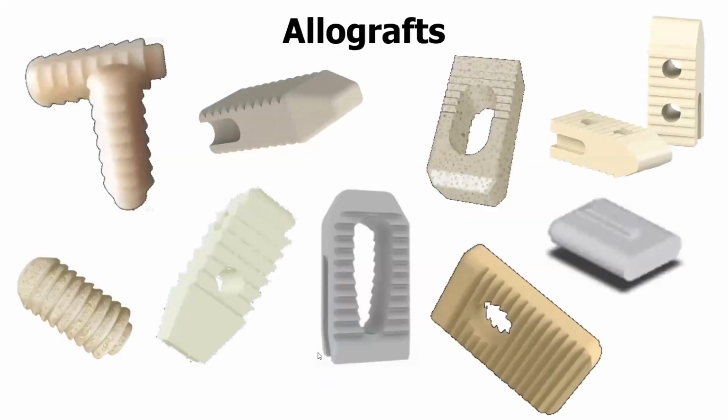There are other joint devices that actually do prepare the joint to some degree, but they also use an allograft type of device, which has its limitations. A lot of them do have some windows that allow for autologous bone to be placed, but the problem with these devices is they tend to resorb and fragment. Most of them are not supplemented by internal fixation, but a lot of these have been developed because of the less rigorous regulatory pathway that allows companies to manufacture and market these devices.